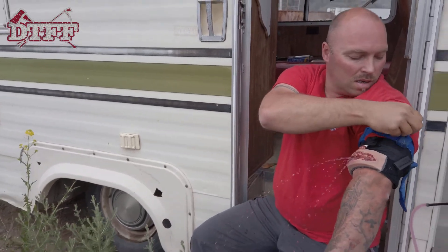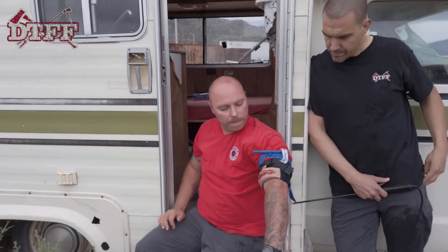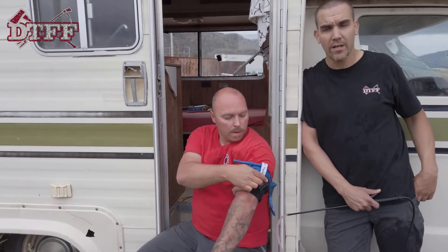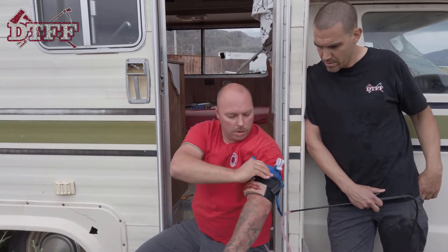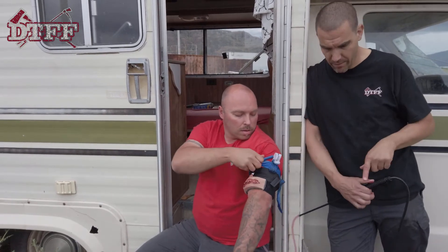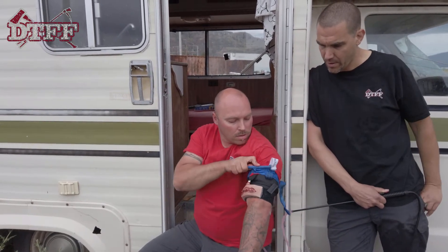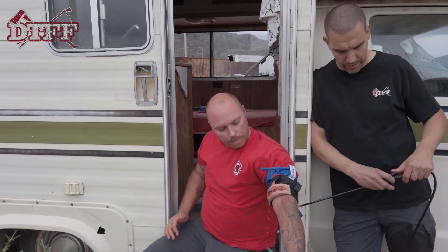You can see the blood is starting to cease. He could probably go tighter if needed, but for training purposes it's got a good purchase. I still have pressure going and he's totally stopped the arterial spray — all we have left is just a little trickle.